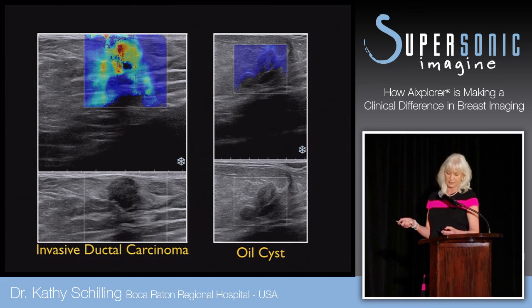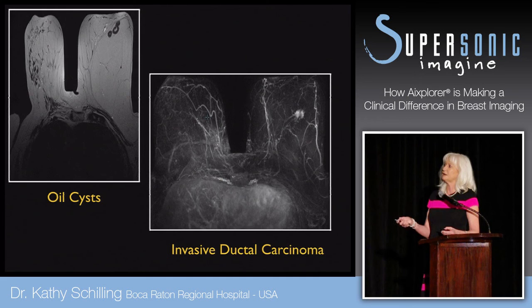And this is her MRI, T2 weighted. You can see this large lipoma. And these are the small oil cysts seen anteriorly with the peripheral calcifications. And on the MIP image, you can see that there's just a solitary irregular spiculated mass consistent with the diagnosed invasive ductal carcinoma.